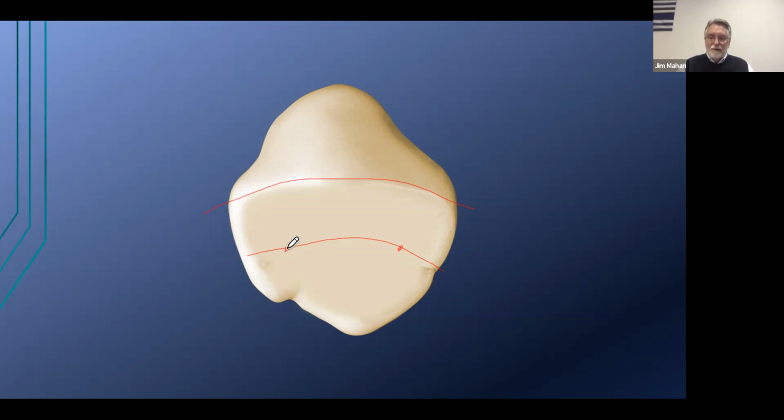So how do I draw the tooth? Same thing, 45 degrees this way, 45 degrees that way, a curving S. Now, if you want sometimes a curve in and then out, there's nothing wrong with that. It's just don't do it consistently, otherwise your cusp ridge will be almost like a cylinder. So here's my cusp ridge. I know it goes from the cusp tip to midway between 2 adjacent pits. That's such a simple thing to determine where the top of the ridge is.